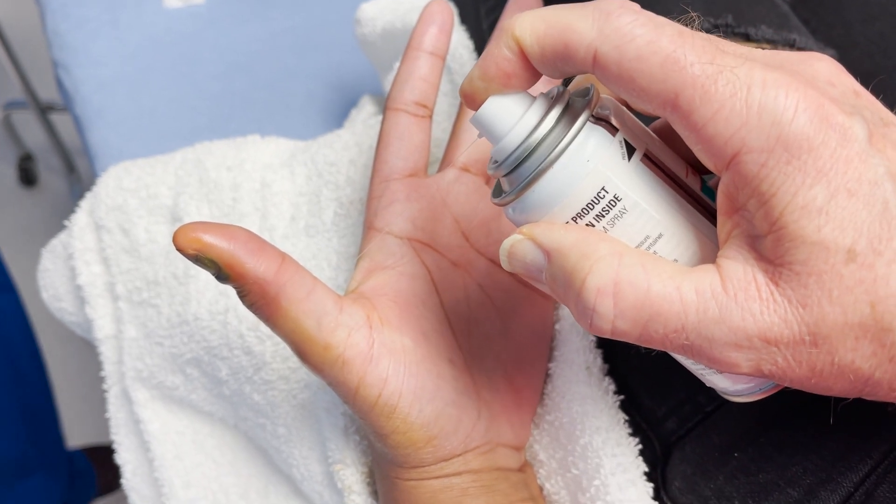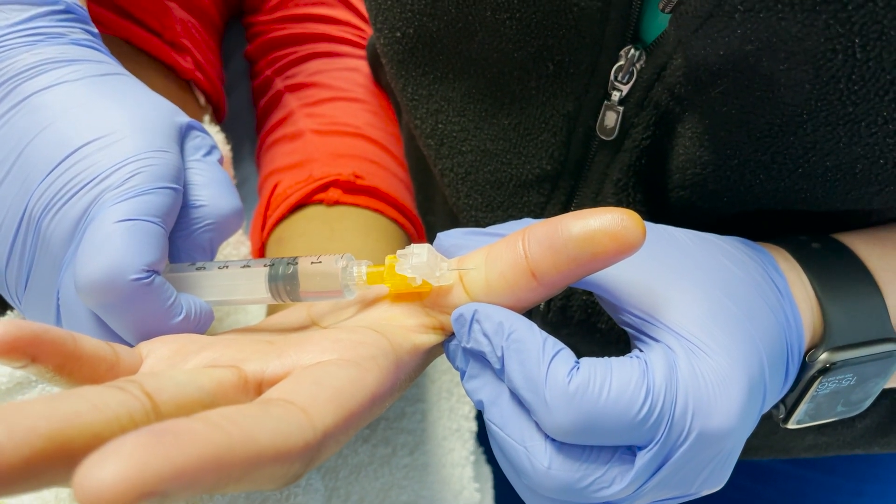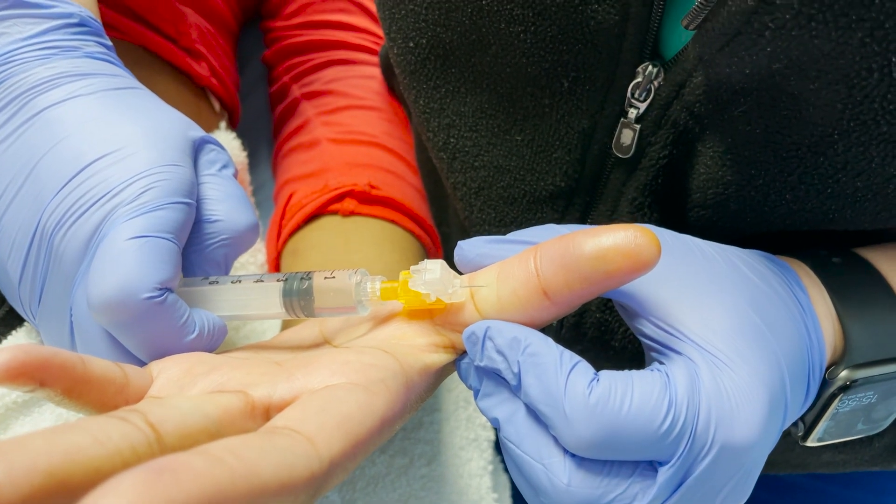We're doing a tumescent block on the volar surface until it gets a little frosty and I think we're about ready to go. Once we feel like we've got it tumescent enough, we'll massage that a little bit too.